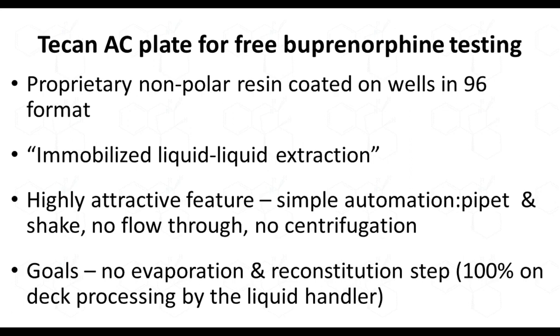So we were interested in using the TECAN AC plate for free buprenorphine testing. We were doing some collaboration with TECAN around developing and validating methods using that extraction medium. If you're not familiar with it, there is a proprietary non-polar resin that's coated on the wells of 96 well format plates. I think that the easiest way to think about how this extraction works is that it's an immobilized liquid-liquid extraction. So your analytes are going to partition into that non-polar resin in the same manner that they would partition into, let's say, an immiscible organic phase like hexane or ethyl acetate from your urine sample.